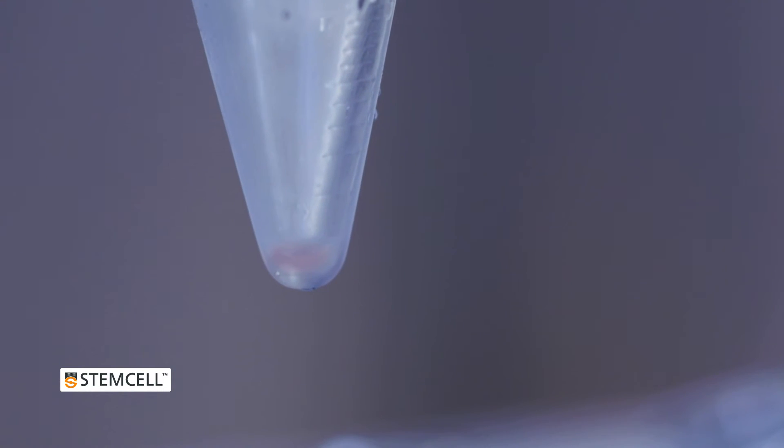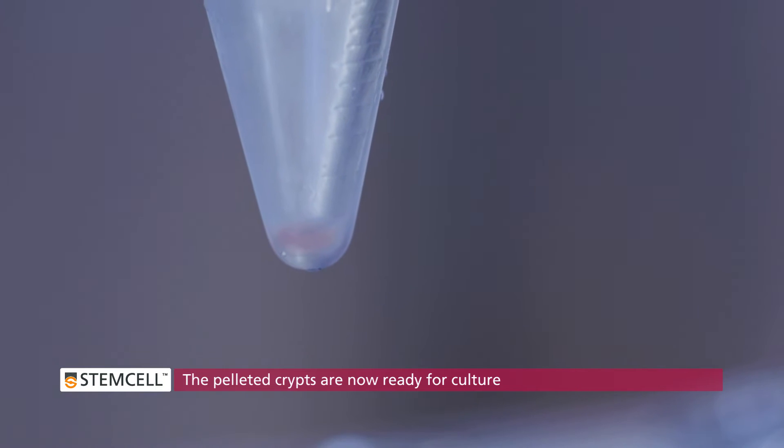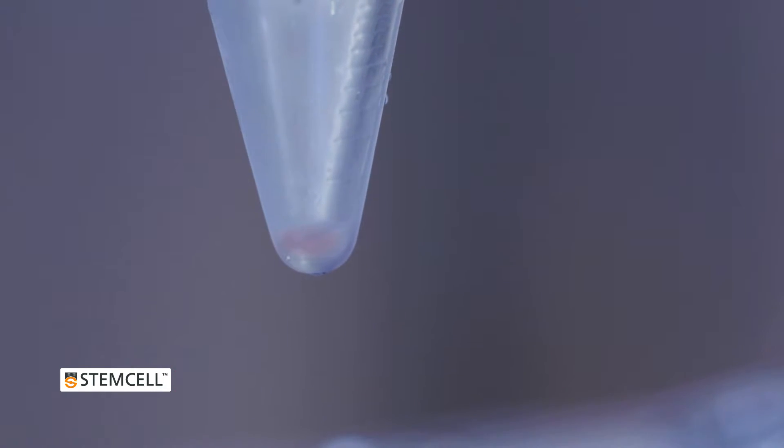The pelleted crypts are now ready for culture in a 1 to 1 mixture of culture medium and matrigel. From this point in the procedure forward, the technique for culturing the pelleted sample is identical to that used to culture freshly isolated intestinal crypts.